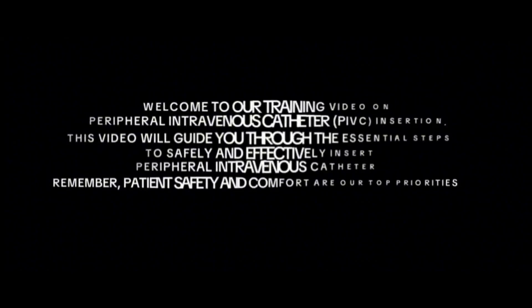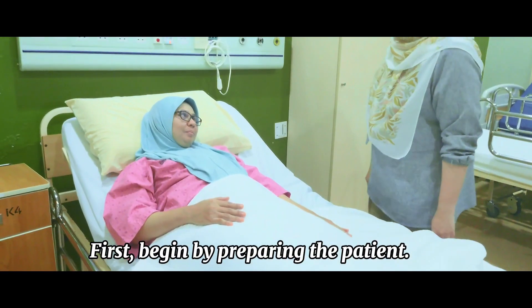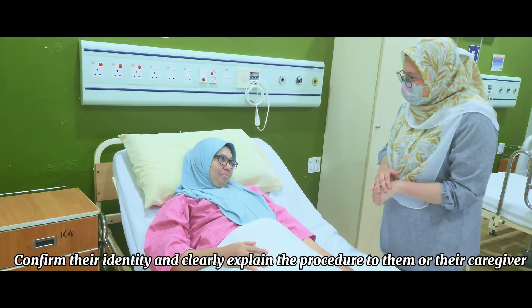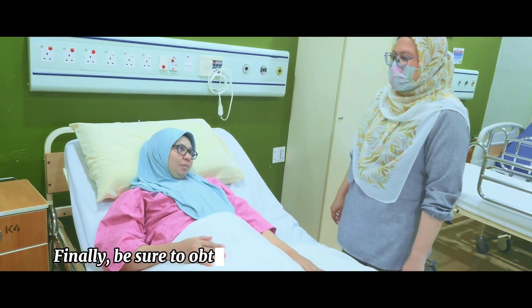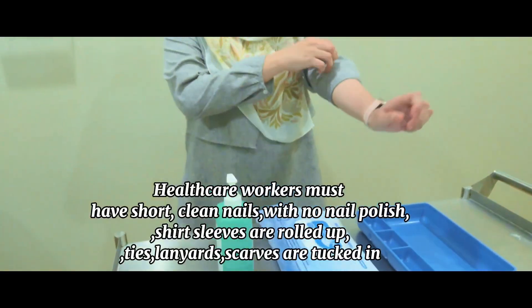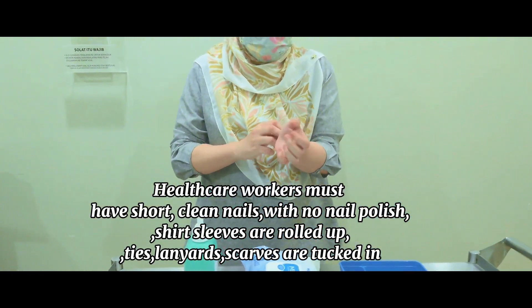First, begin by preparing the patient. Confirm their identity and clearly explain the procedure to them or their caregiver. Ask about any past issues with intravenous insertions or any known allergies to antiseptic. Finally, be sure to obtain verbal consent before proceeding. Remember, patient safety and comfort are our top priorities.